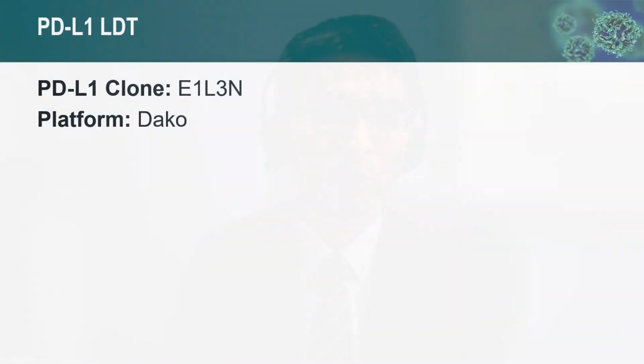So Dr. Hung, given that you all run the Leica platform, tell us how the decision was made to select the antibody clone that you are using currently. The history of how we adopted the PD-L1 testing at Massachusetts General Hospital: our sister hospital, Brigham and Women's Hospital, adopted PD-L1 testing. They have the Dako staining platform, but they use the Cell Signaling E1L3N clone just a few months earlier than us, I believe. And so within a pretty short time, we chose that clone partly because we heard good performance from our colleagues, but also in terms of cost consideration at the time as well.